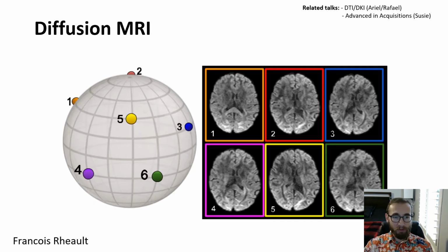The first important thing to consider for diffusion MRI is the acquisition itself. Most people are familiar with spatial resolution, which is the size of the different voxels that you can have when you do an acquisition, the size of the smallest structure that you can look at in 3D. Diffusion MRI has an extra layer of complexity on top of it: angular resolution.